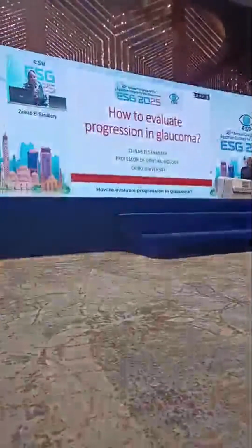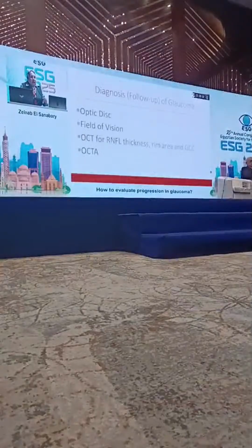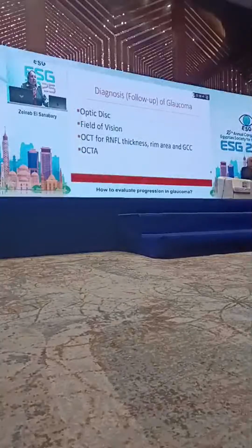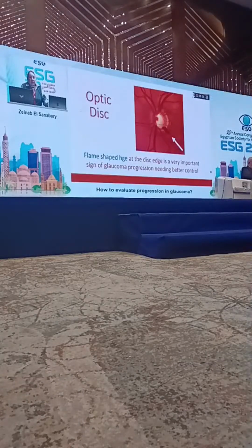We come to the end of the session, and at the end of the session we'll talk about the evaluation of progression in glaucoma. As we all know, we always diagnose glaucoma by the optic disc, the field of vision, the OCT for retinal nerve fiber layer, and the OCTA, and these factors will also be used for evaluation of progression. For example, for the optic disc, when we see a flame-shaped hemorrhage like this, it means that this patient is not controlled well and he needs better control.